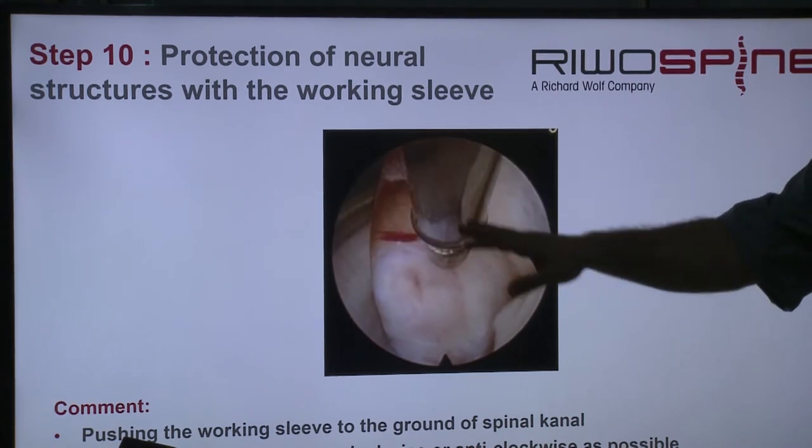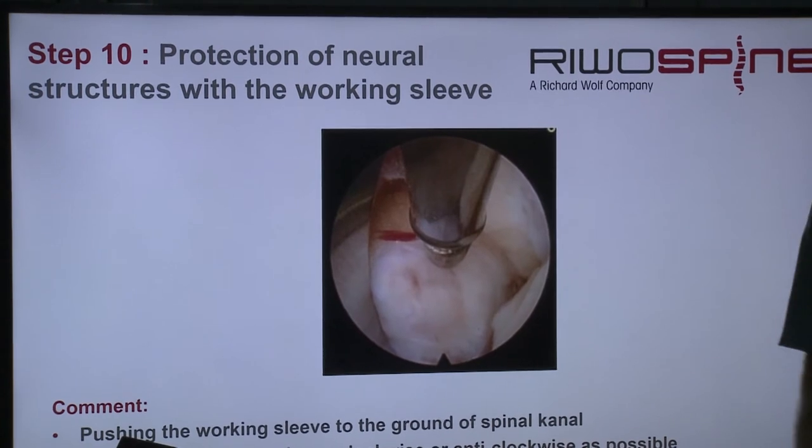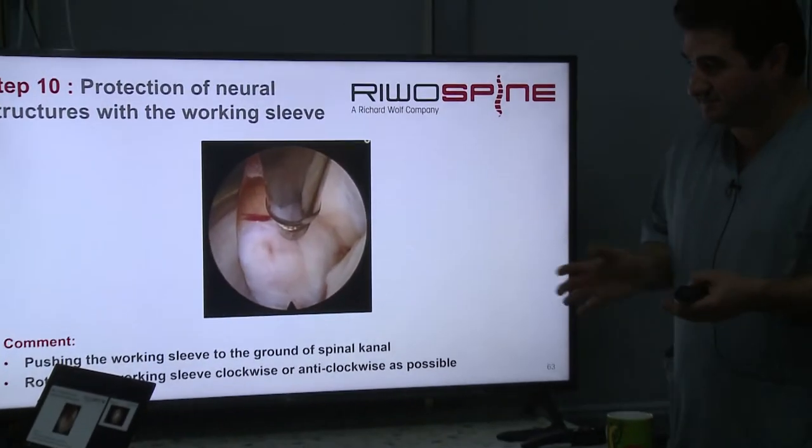It's well designed here. I have never seen any problem. Of course, you can have a problem, but you have to press the sleeve down and rotate it. But it's very safe.